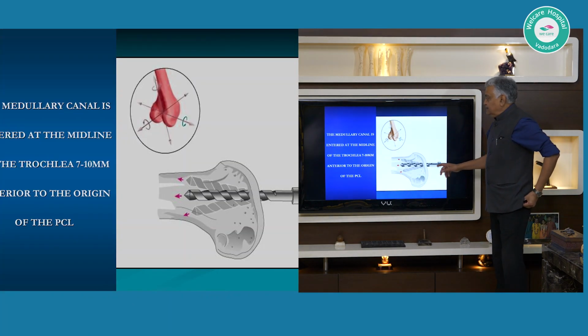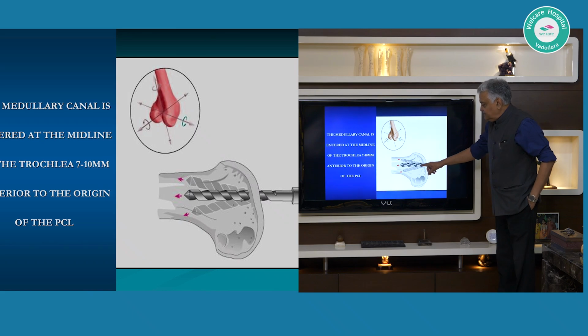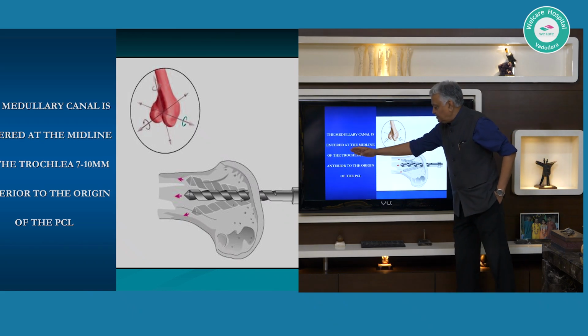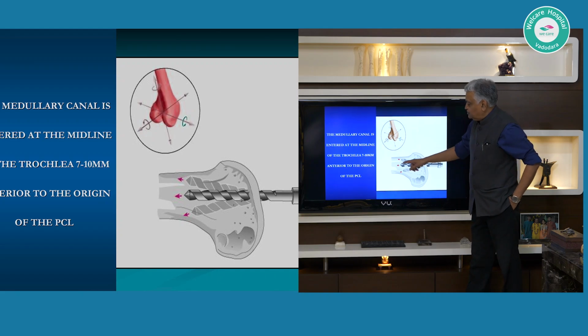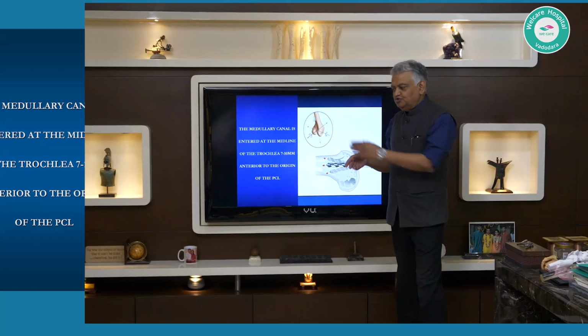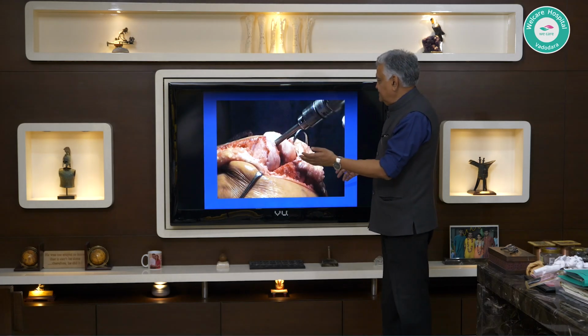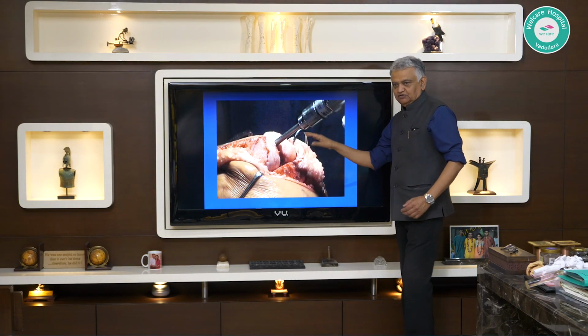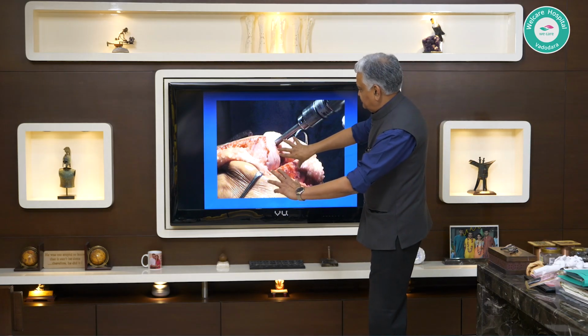So now go to the next diagrammatic representation. See here. He has taken it so that the entry point, once you put your rod in there, will allow the rod to not hit this or that. And this is a visual judgment on the table. When you are choosing this from this side, because this is a lateral photograph, taken from the lateral side.